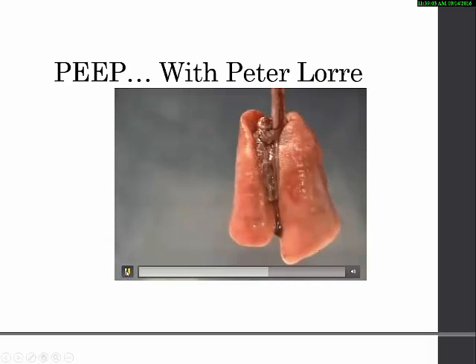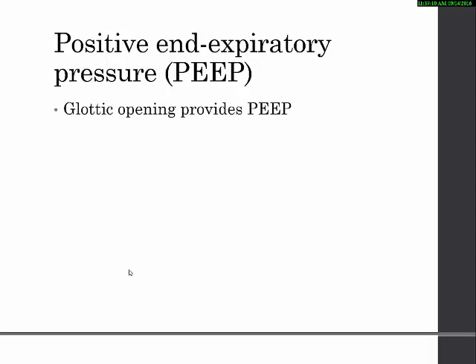All right, so that's pretty much what we're doing when we're trying to put PEEP on a patient. That is what CPAP does for your patients, and that is what PEEP on the ventilator setting does for your patient.